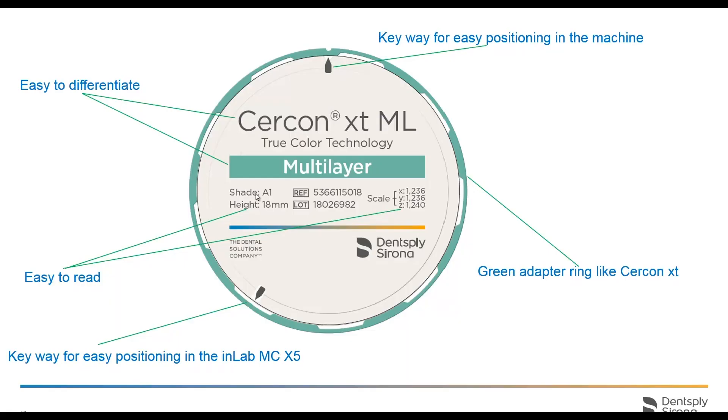You can see we have our shade, height, our scale, our X, Y, and Z that we entered in just now. The keyway at the top is for third-party mills and the bottom is for the InLab MCX5.